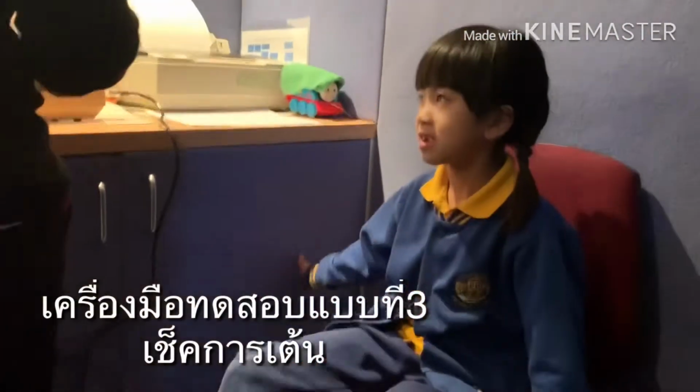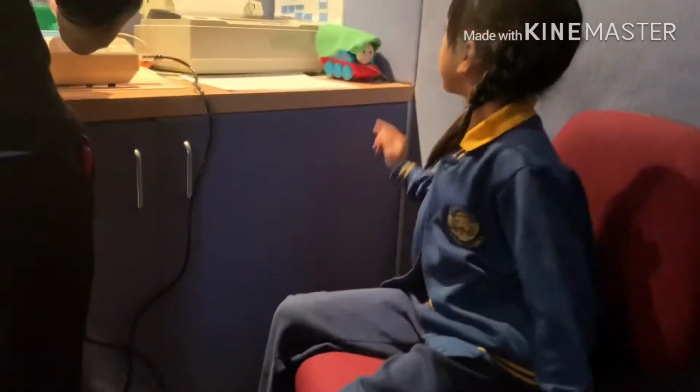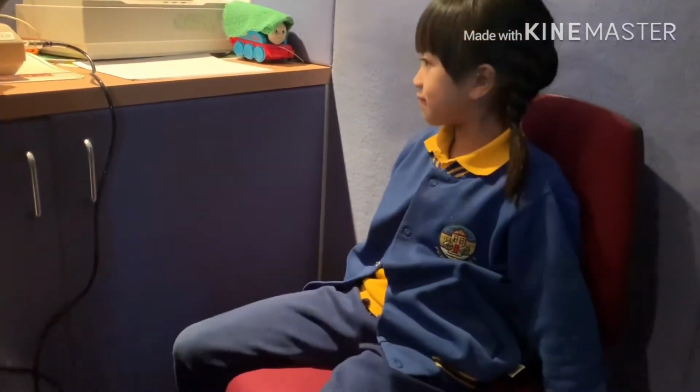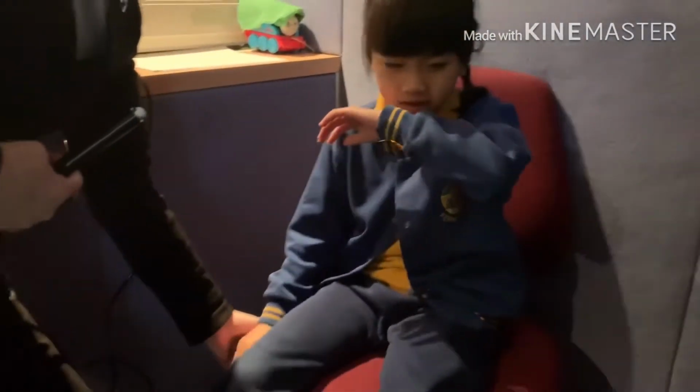This is called a tympanometer. The other one is an audiometer. The tympanometer checks the eardrum. It has a printer, and that's a very old printer, isn't it? Okay, so we start with the right ear like we did with the hearing test.